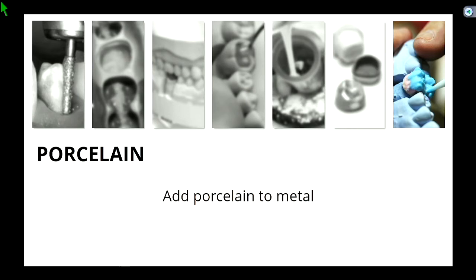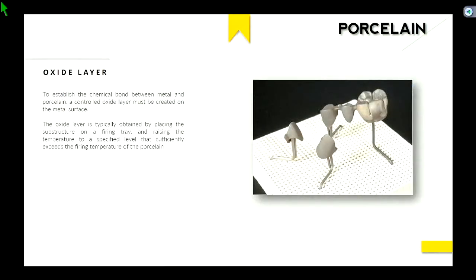And ethyl silicate is only used for our removable partial denture metal frameworks, and we'll have a slide on that in this lecture. So you don't need to know too much about RPDs just yet. You'll get that in November, but just know that the ethyl silicate is used to invest our metal framework for removable partial dentures. All right, so we get our coping casted.